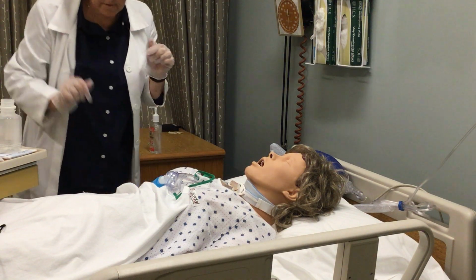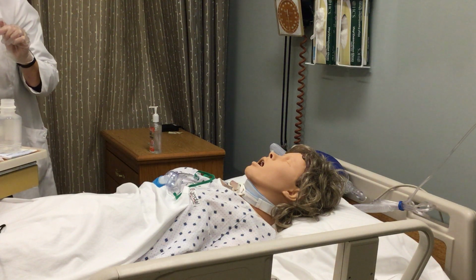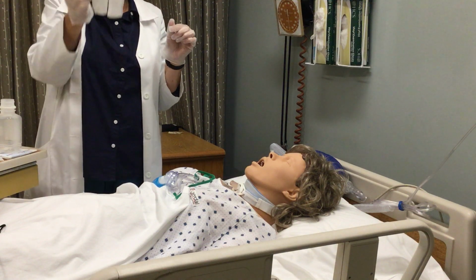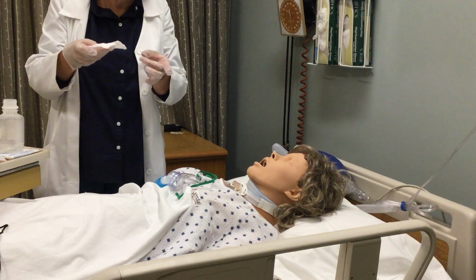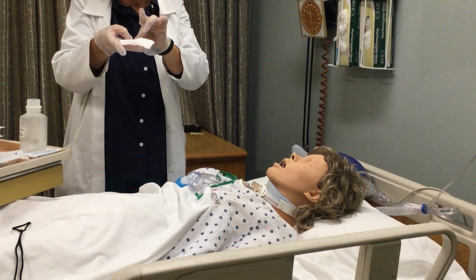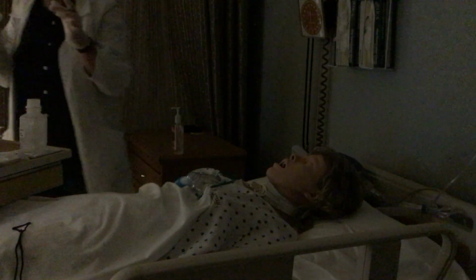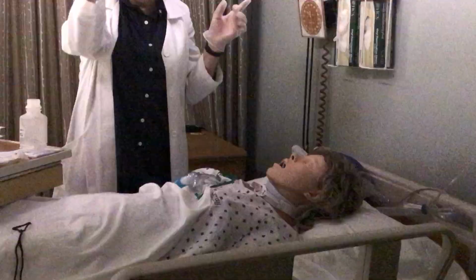Okay, so I've dried that off. Apply a new drainage sponge. So here's my new drainage sponge. Kind of looks like SpongeBob's pants. At this point you don't have to really be sterile, but more clean. So I grab the little pant legs and fold them up, and then I pinch them right at the seam.